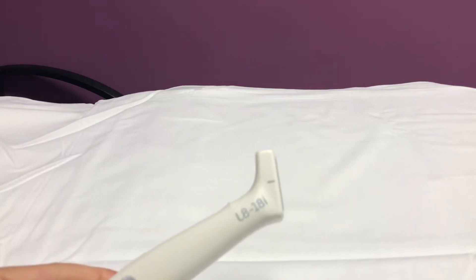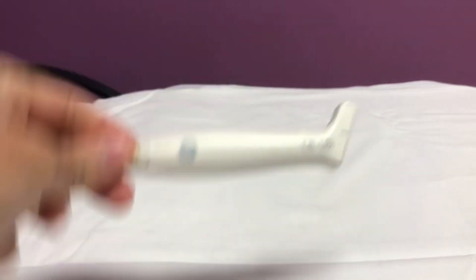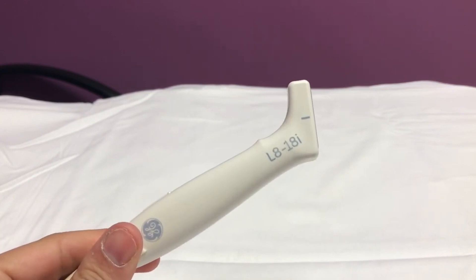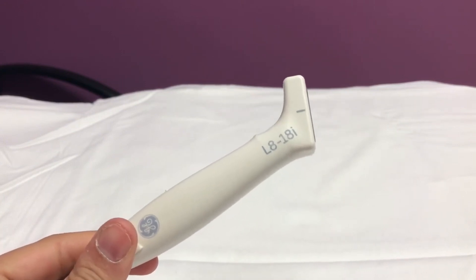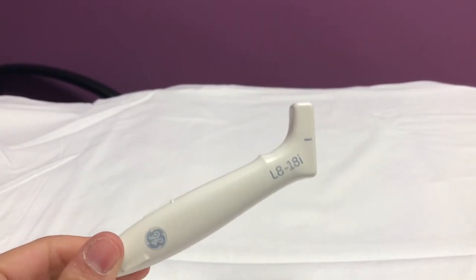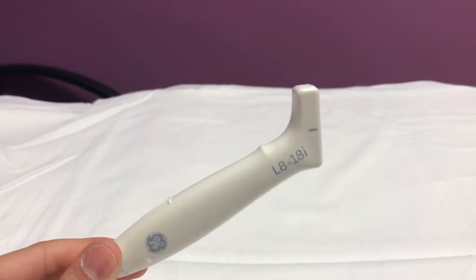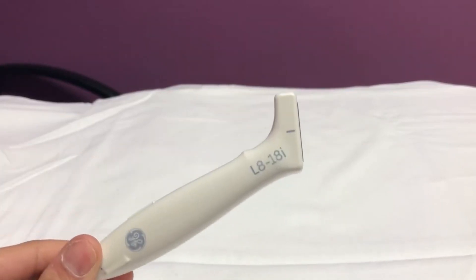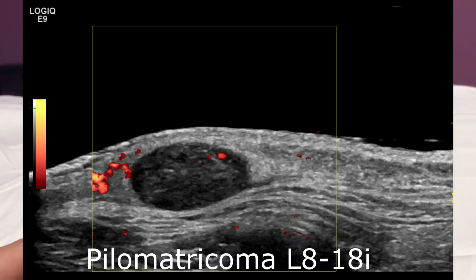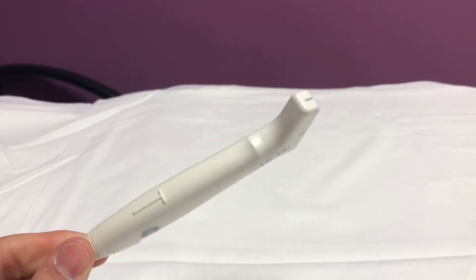Here we have another linear probe — the L818i, also known as the hockey stick because it looks like a hockey stick. I love this probe. Anything really superficial: fingers, musculoskeletal, eyelid, lip, any soft tissue on a superficial structure — this is amazing. I've scanned baby brains on extreme preemies, we're talking 25, 26 weeks, and the resolution you can get on brains is amazing. I posted a video showing the different layers of the dura the other day, and this is the probe I used. The imaging is just impressive — lesions on the face, pilomatricomas, you can use this on the dorsalis pedis artery on the foot, radial arteries, cephalic veins. You get really, really beautiful images with this.